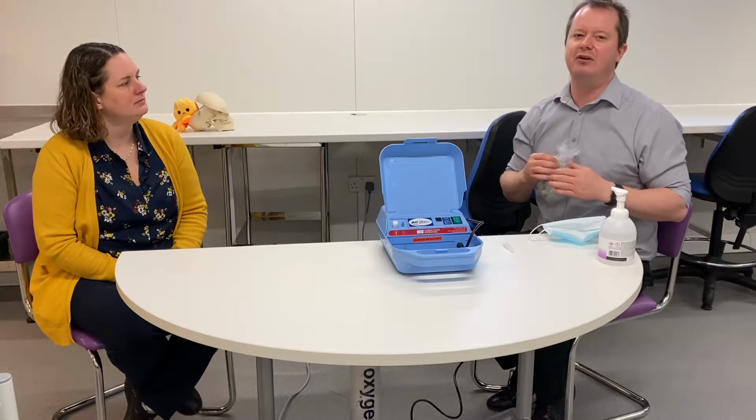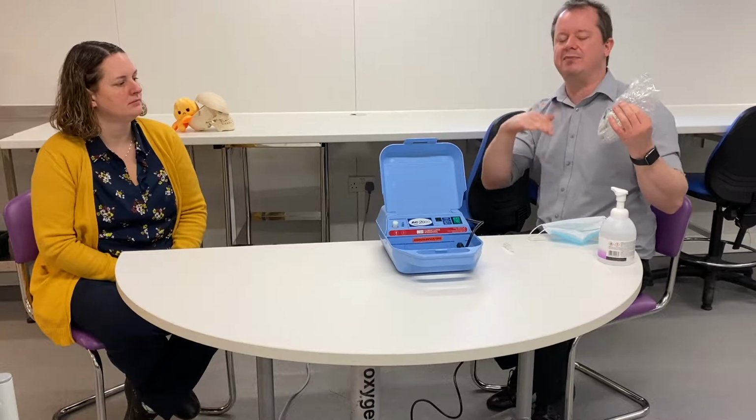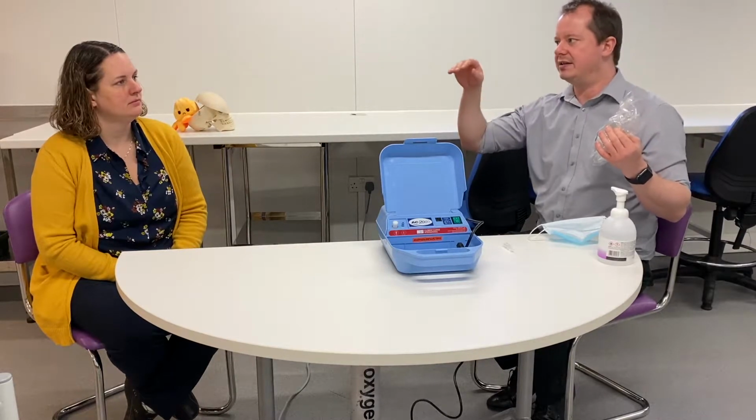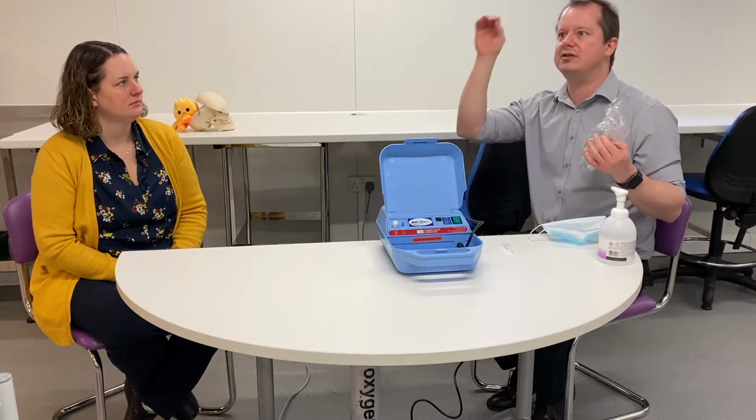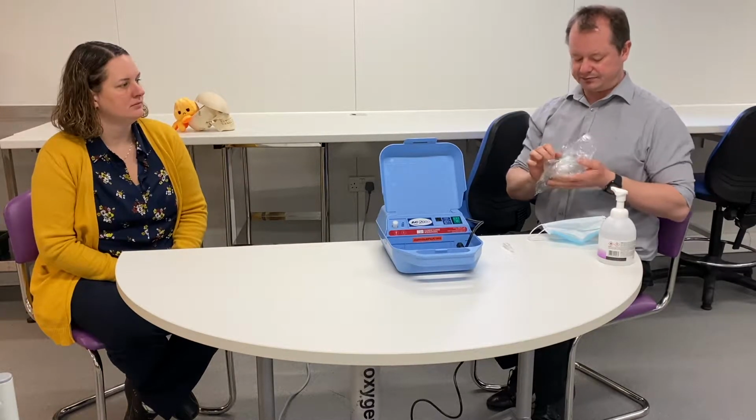Yes. If we're going to give a medication to a patient, we need to do all the things that we did in the inhaled medication video. So if it's prescribed, we need to check the prescription in the same way: name of drug, dose, route. It's been signed and dated, and you can read it properly.